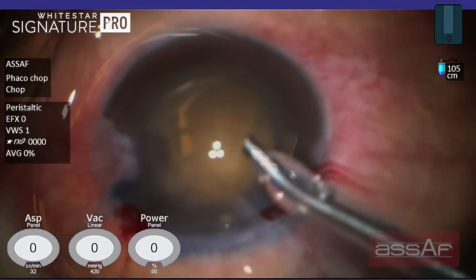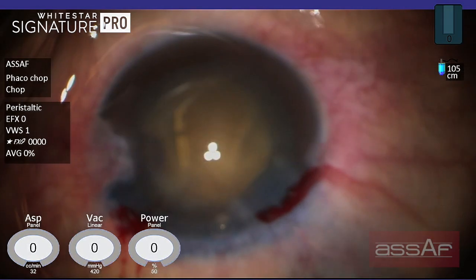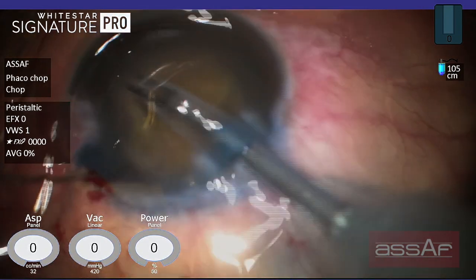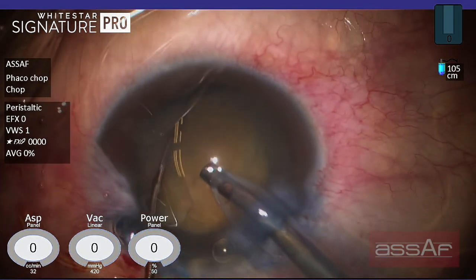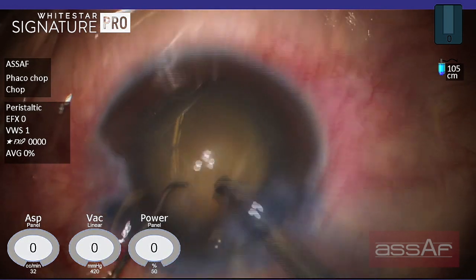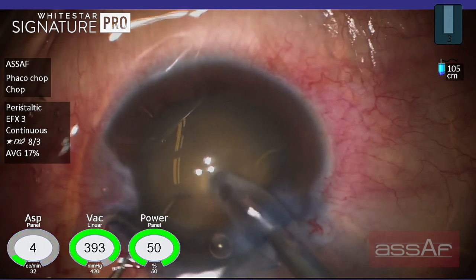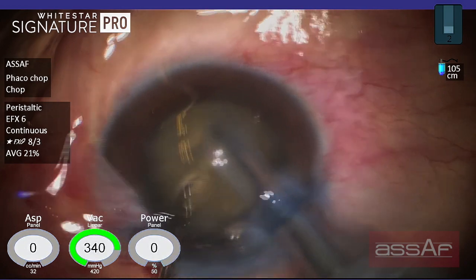Before proceeding to emulsification, I found that the phaco tip is exposed more than I want, so I'm adjusting the sleeve to expose only 1.5 millimeter from the phaco tip. In these cases I would like to apply the quick chop technique as I described before, by applying a little bit of ultrasound to impale the phaco tip with high vacuum in the very center of the nucleus.